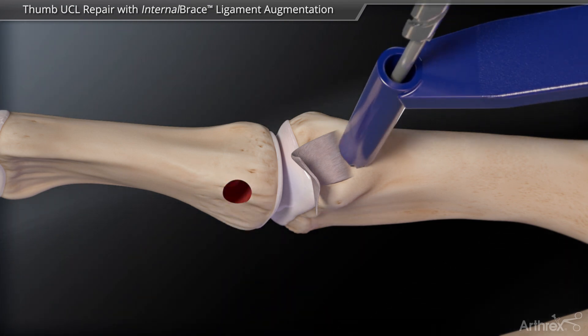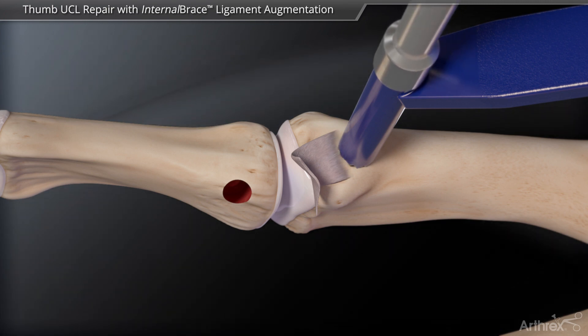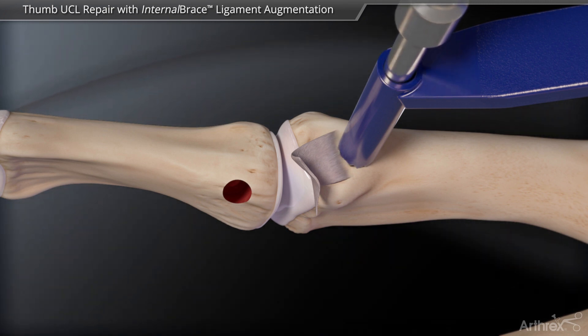A mini push lock with accompanying 1.8 mm drill can be used on the proximal phalanx to accommodate smaller anatomy when needed.